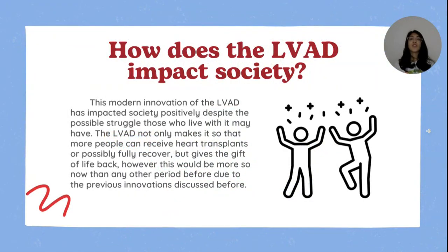So, how does the LVAD impact society? The LVAD has impacted society positively despite the possible struggle for those who live with it. Again, it is a burden to have. You cannot shower with it. You cannot go to the beach. If power goes out, your life could be compromised. However, the LVAD ultimately does give the gift of life back. This is more so now than any other period through the past innovations discussed before.